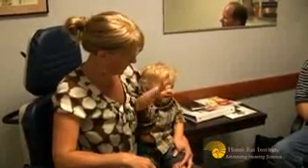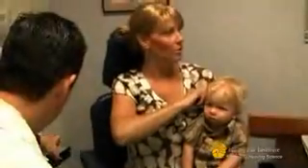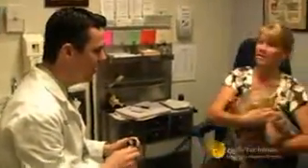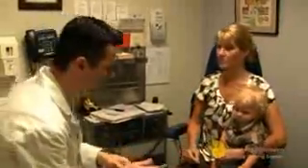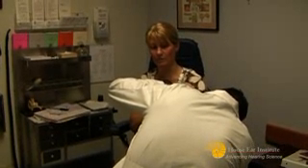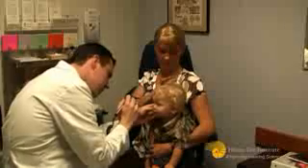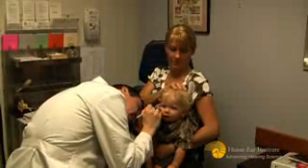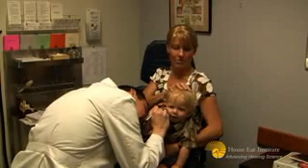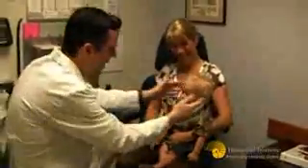I called almost every day too. I'll let you know as things go along. Once we get the first implant in, we'll have the nurse call you and then we'll keep going with the other side. You are a good boy with that nice clear eardrum. Can I look at the other one? You're such a good patient. You've got nice looking ears. You bet they don't work — we'll get them going here.